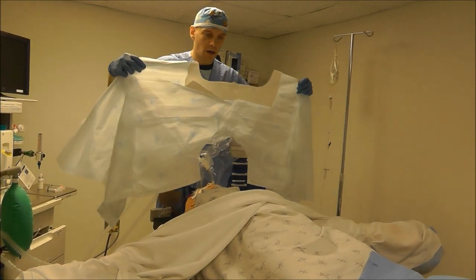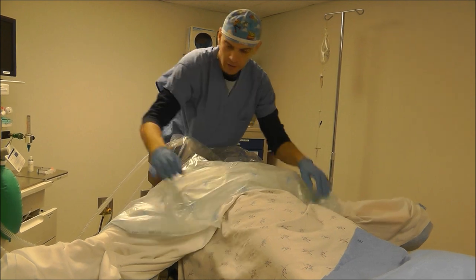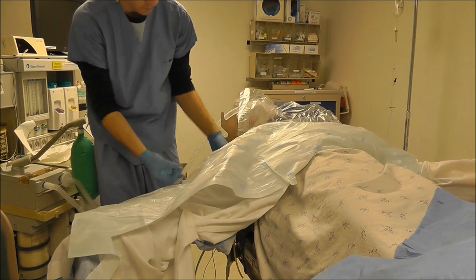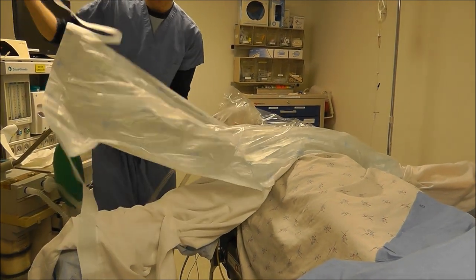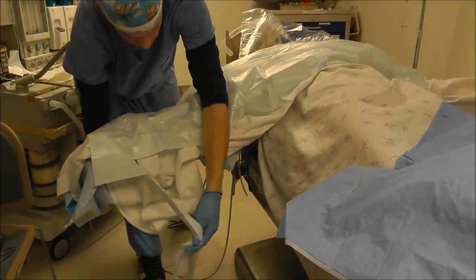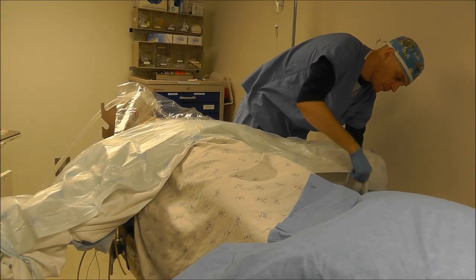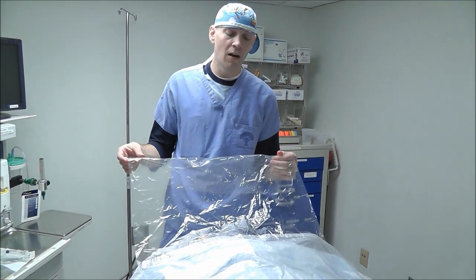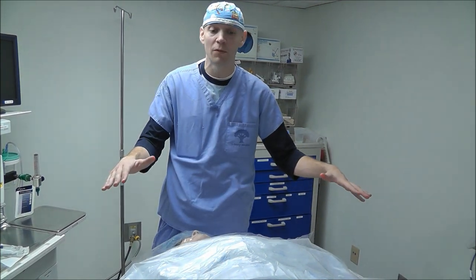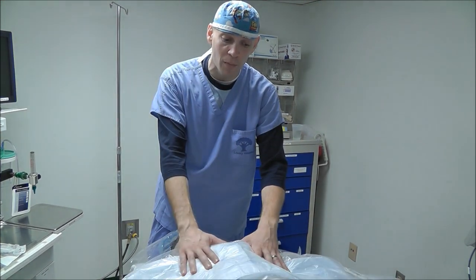The bear hugger is designed to go on the patient like this. Remove the sticker, place it right there, pull the little tabs, and then tie it underneath the patient. Once the bear hugger is on, make sure you don't turn it on until the patient is draped — you don't want air blowing all over the sterile field.